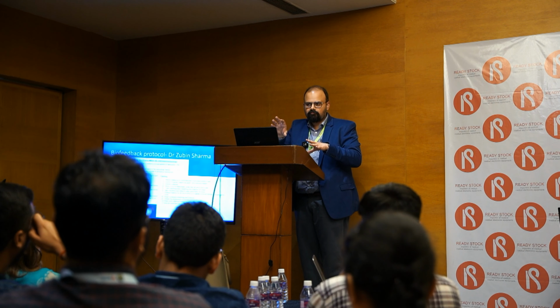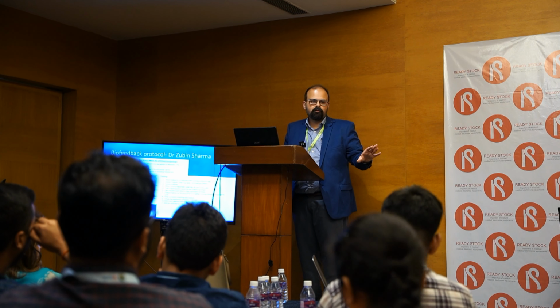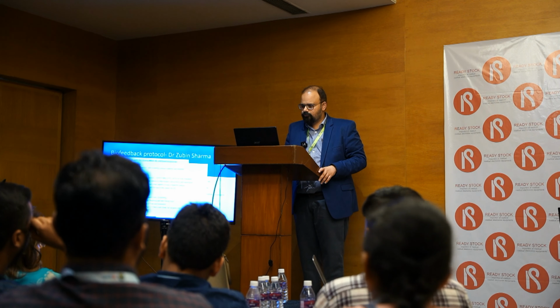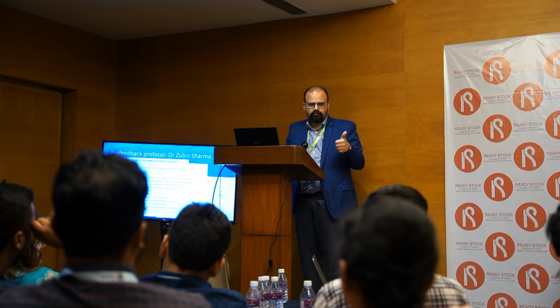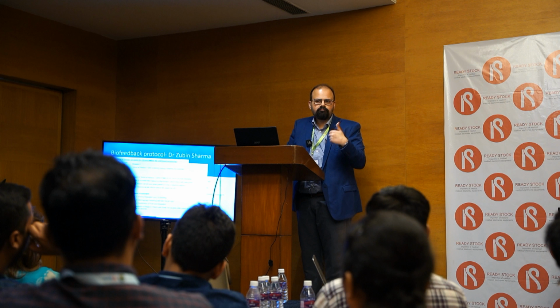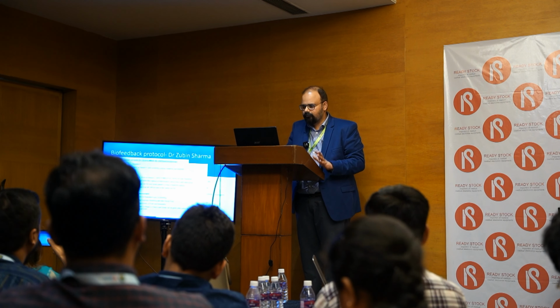You can't have them skip diaphragmatic breathing and just start push training. So session 2 is again the same thing. In one session they will not learn the correct posture, so you will reinforce it in the next session. It takes 3-4 sessions to learn that.